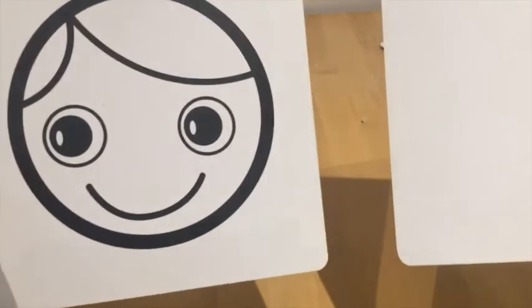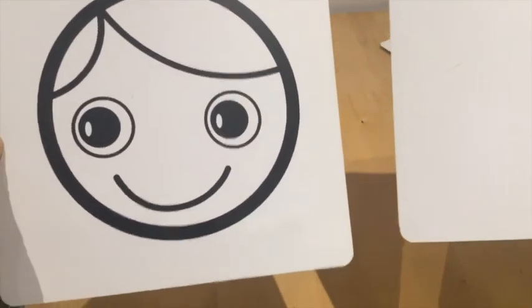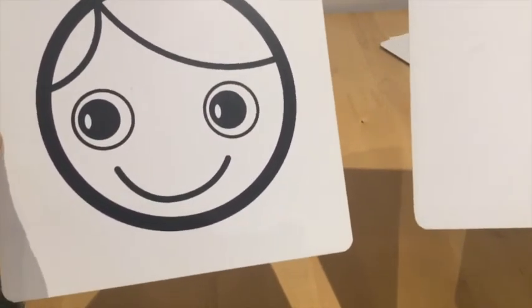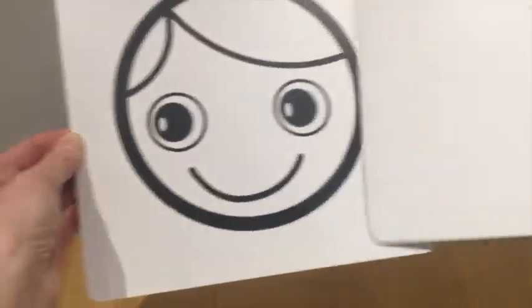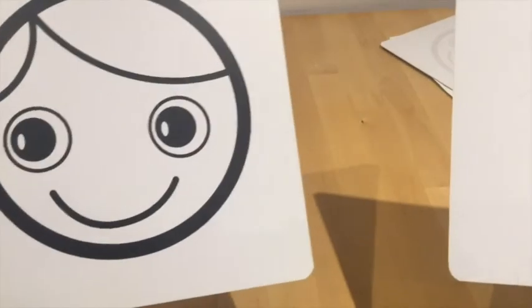You're going to look to see how the child or young person looks at the face rather than at the blank card. Both cards need to move at the same time — what you don't want to do is move only the one with the face on it. Both cards need to move simultaneously.